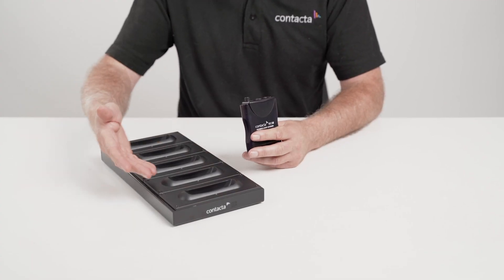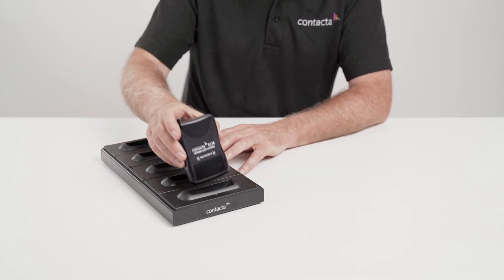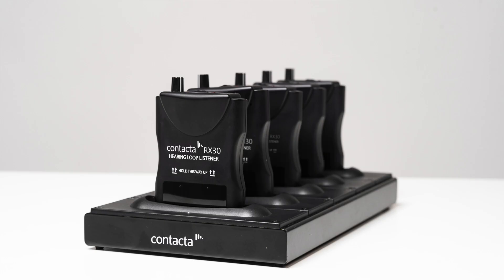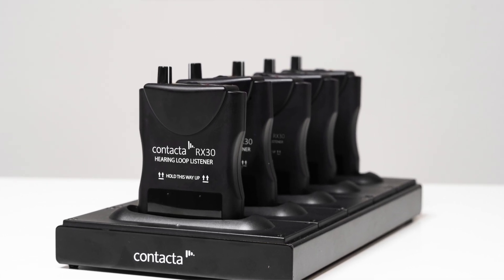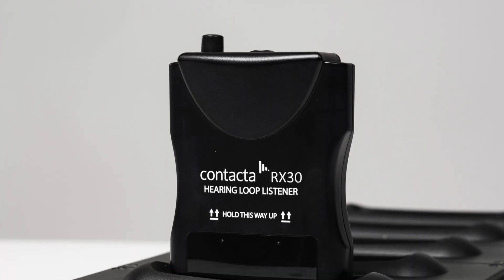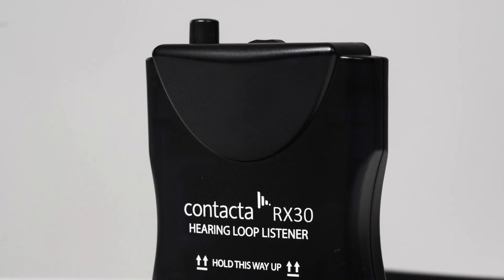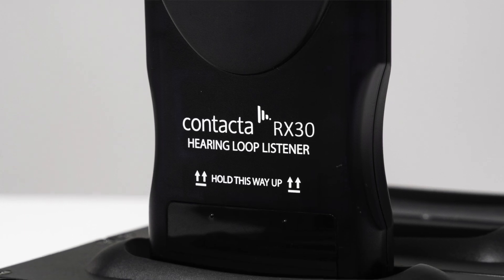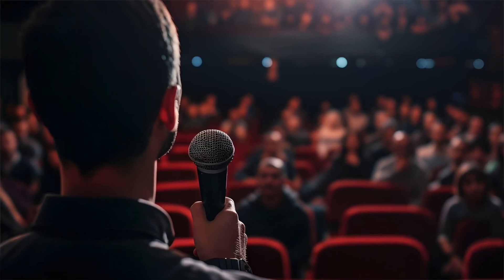The product should ideally be charged after each use by placing the unit into a charging bay. Here we have our DC5 charging bay, which can hold up to five devices in a standing position. Your venue may have a number of these fitted or a charging bay with a different number. Place the RX30 unit into the bay ensuring it makes good contact with the charging pins. A red LED will indicate that the unit is being charged. The charge time to full capacity is approximately 6 hours. Prior to using the device for the first time, the rechargeable batteries should be charged for at least 10 hours.